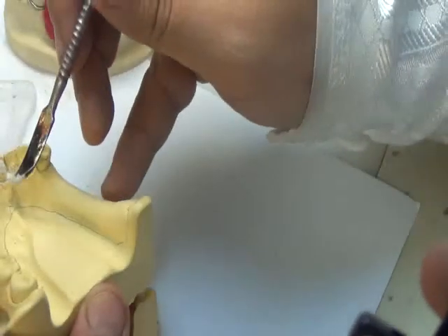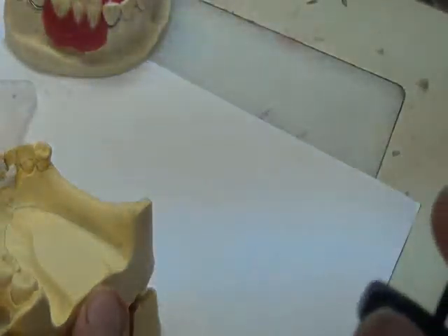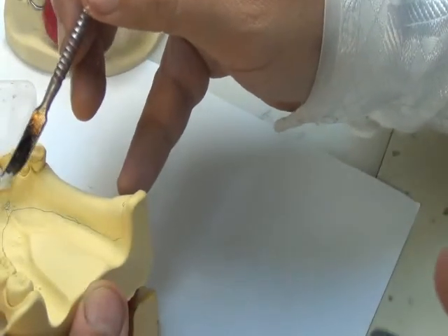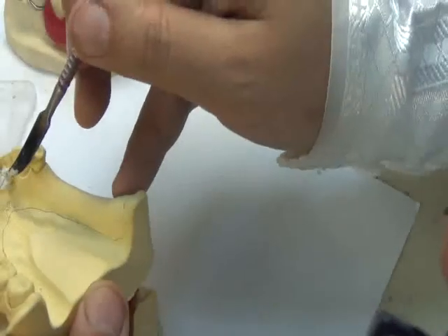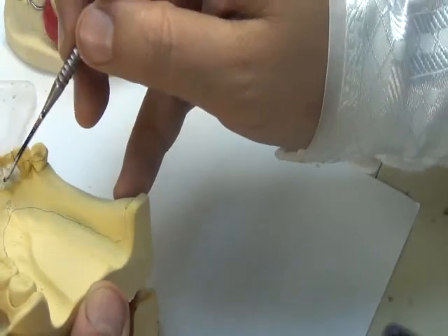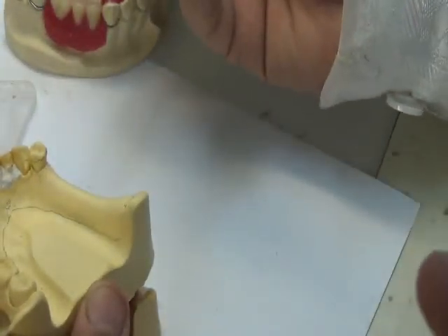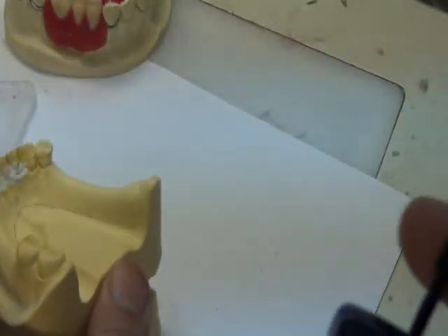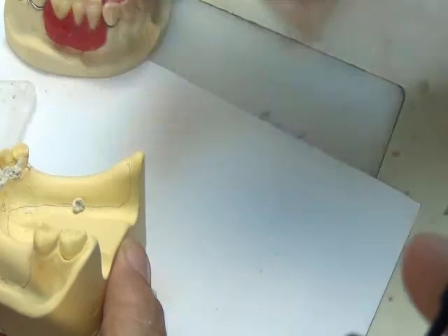Another question that arises: why am I using plaster? Why not block them with wax, as we have done in the denture procedure? Because I'm replacing all wax in this wax-up of the denture by acrylic. So if I block these undercuts using wax, the wax will melt down during the dewaxing step, and acrylic will come in its place. So I'd have as if I have done nothing. So for the blockage that I use for the temporary RPD, I use plaster and not wax.